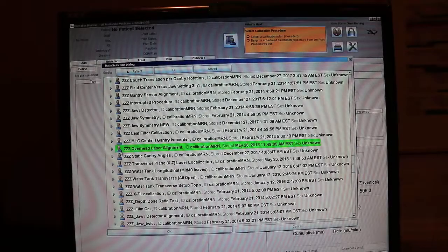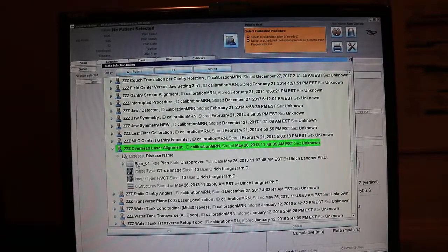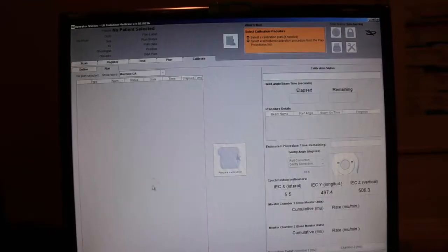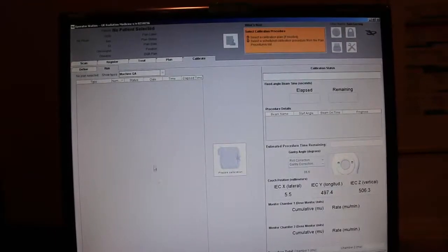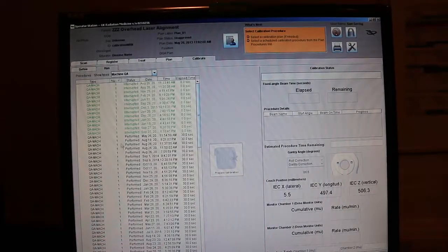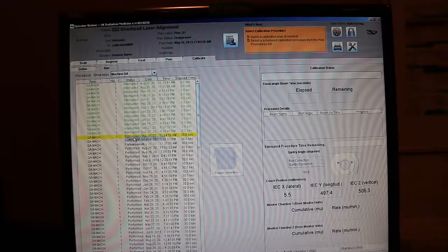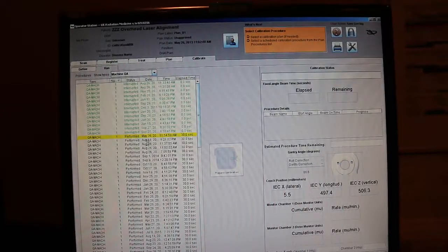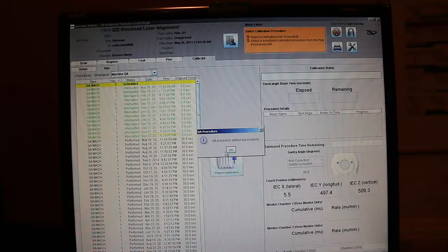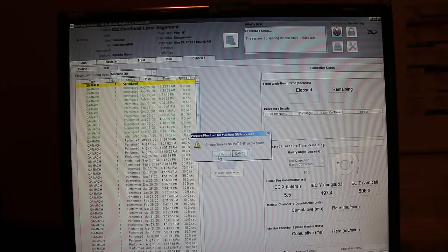Outside at the operator station we're going to pull up the overhead laser alignment patient. We can generate a QA procedure and click prepare calibration and we can head back inside.